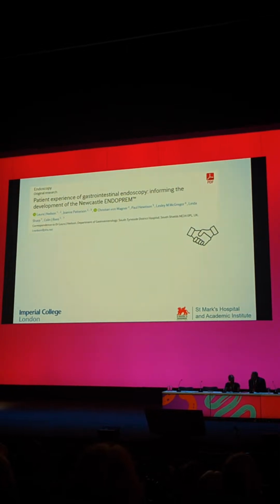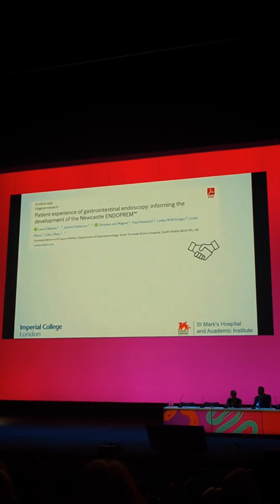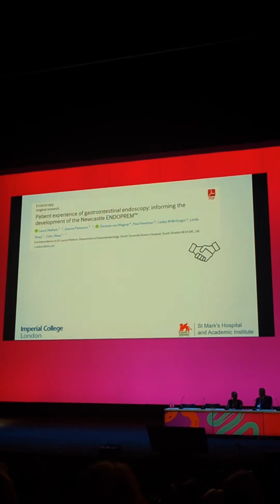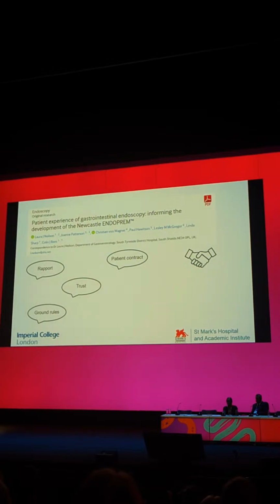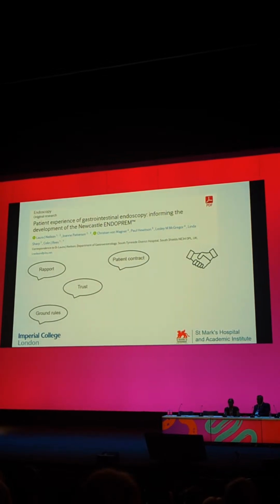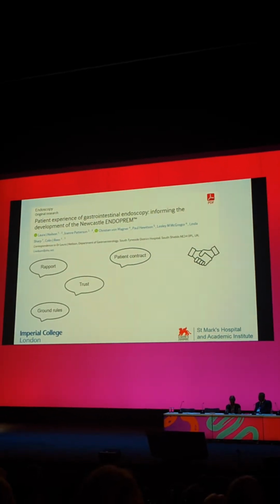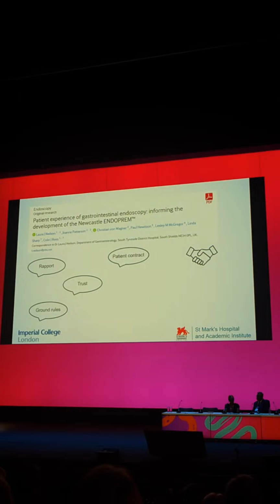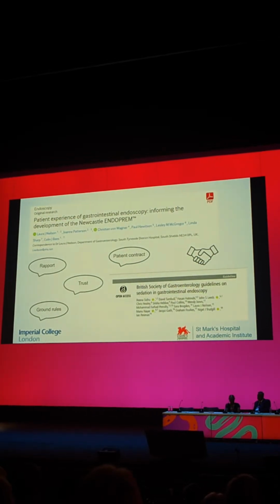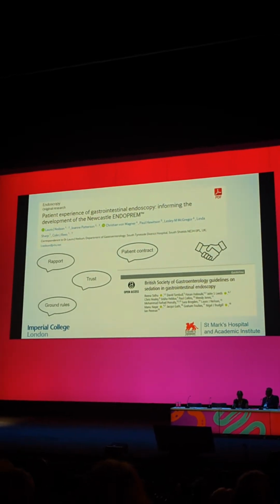And we know that lots of our patient-reported outcomes are clinician-orientated, whereas the team at Newcastle have talked about patient-derived outcomes. And we know that endoscopy is traumatic, even though we like to do endoscopy to patients. Patients' experience of it is challenging. Your intubation is really important to get right, because it's the bit where you develop a rapport, you can build trust, you can set ground rules, and also it's a patient contract. So they know what to expect and you know what they've agreed to. So for example, if a patient wants the procedure to stop at any point, you have an understanding of how you're going to do that. And really, I think this comes onto patient comfort and acceptability of the procedure and tolerance, and this leads nicely into the updated sedation guidelines.